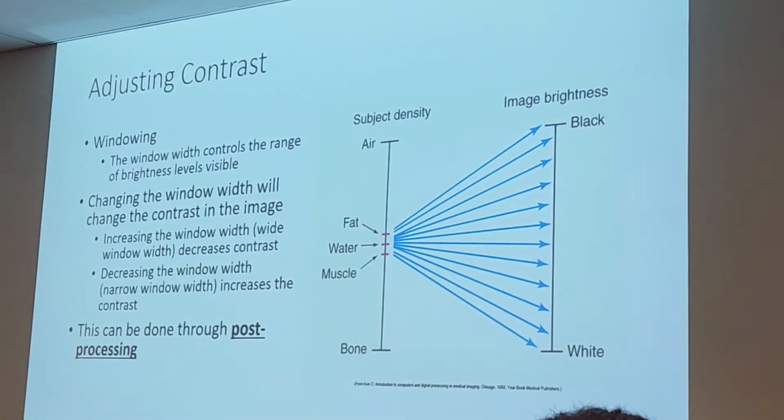What do we call changes in contrast? Windowing. So be careful. Make sure you know which one goes with which. So, Samantha, leveling goes with which one? That goes with windowing. Brightness or contrast?